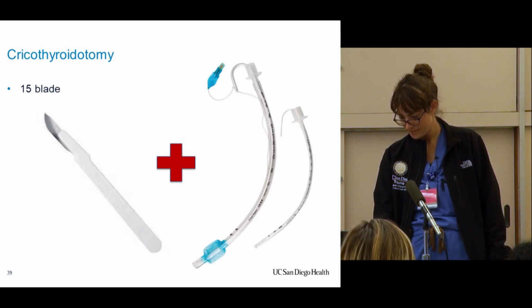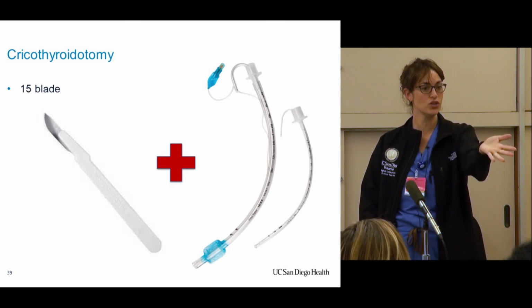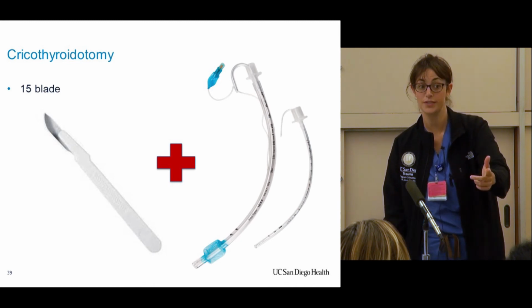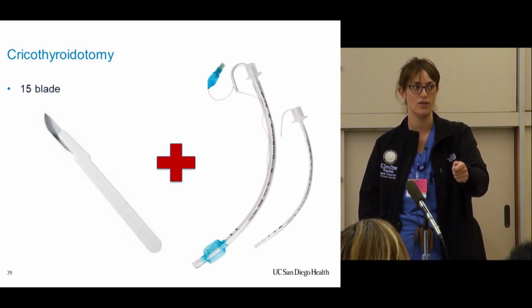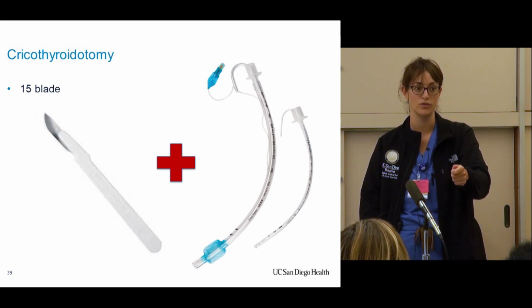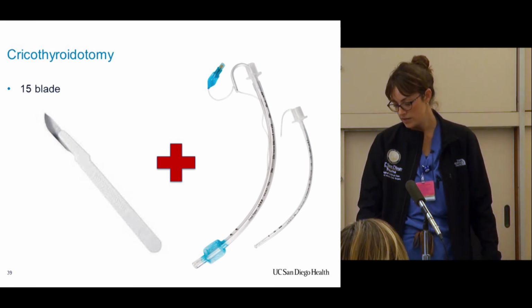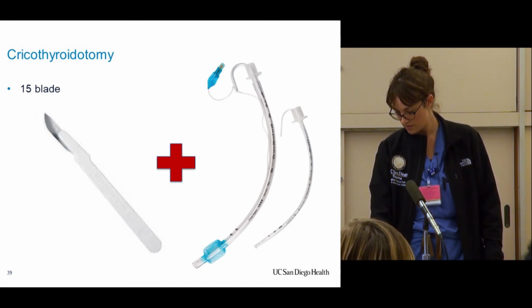So you keep saying 15 blade. I remember we have only 10 and 11. That's right, so that's fine. That's a good question. Yes, you can use an 11 blade. You could use a 10 blade too. Maybe the more important thing is when you hand it to somebody, tell them what it is, because it makes a difference how you use it. So in an emergency, at least they know what's in their hand.